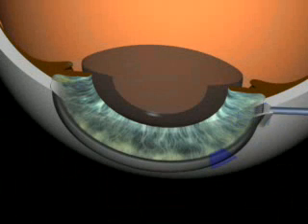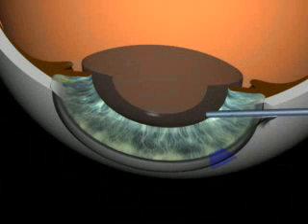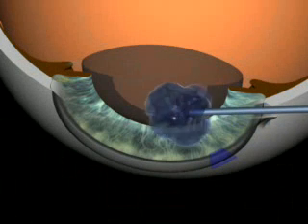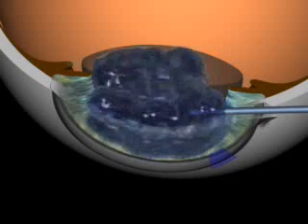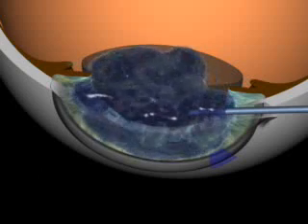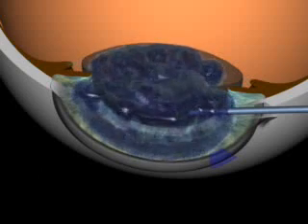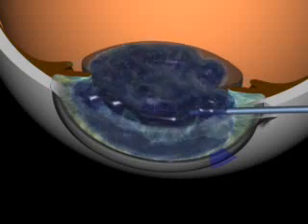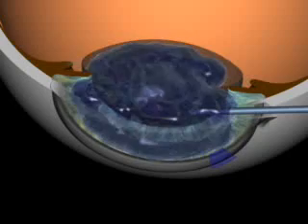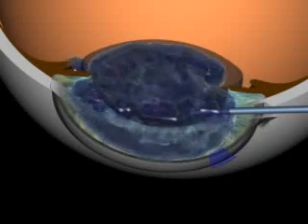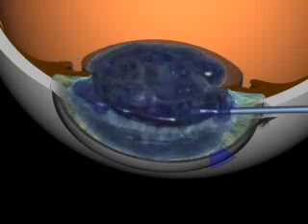Injection of viscoelastic. Once again, a viscoelastic substance is injected to fill the capsule bag for implantation of the IOL, the intraocular lens.